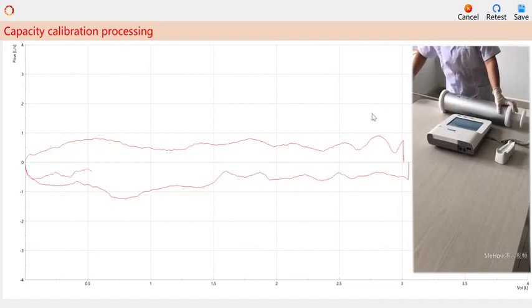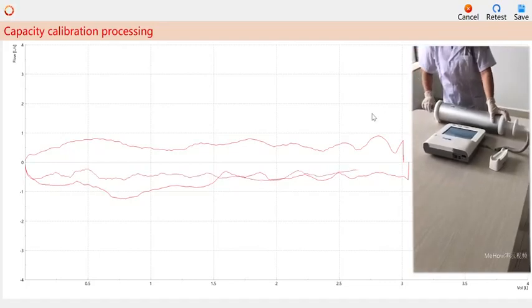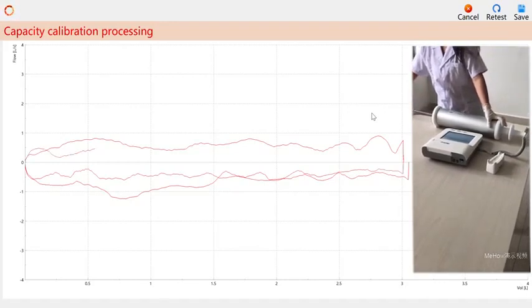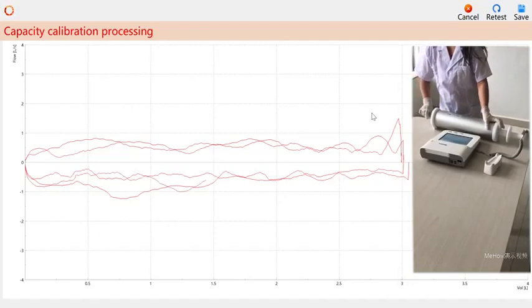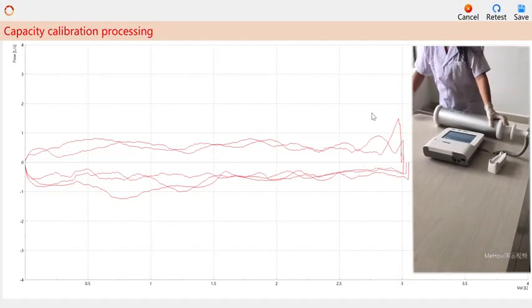Push and pull repeatedly for 3 times, and keep a constant speed each time. Push and pull to the end with a thumb, indicating that you have pushed and pulled to the end, and you can take the next action. Push again, hand on the head or tail of the calibration barrel, and do not touch the barrel body.